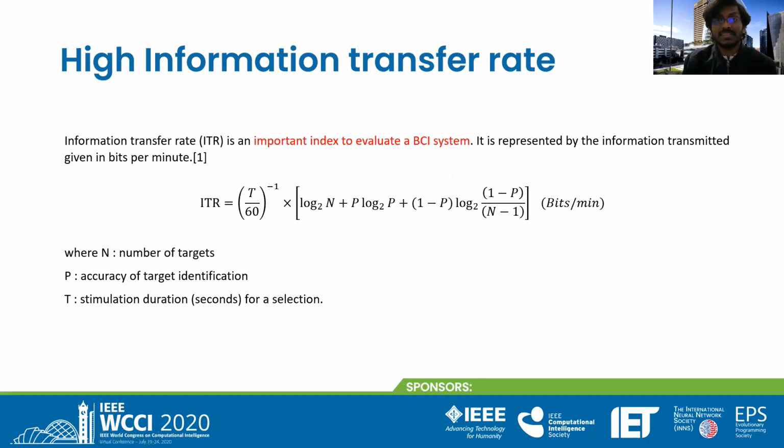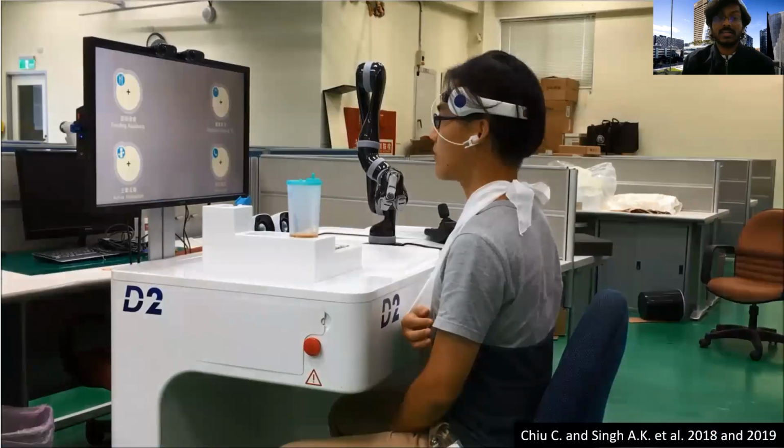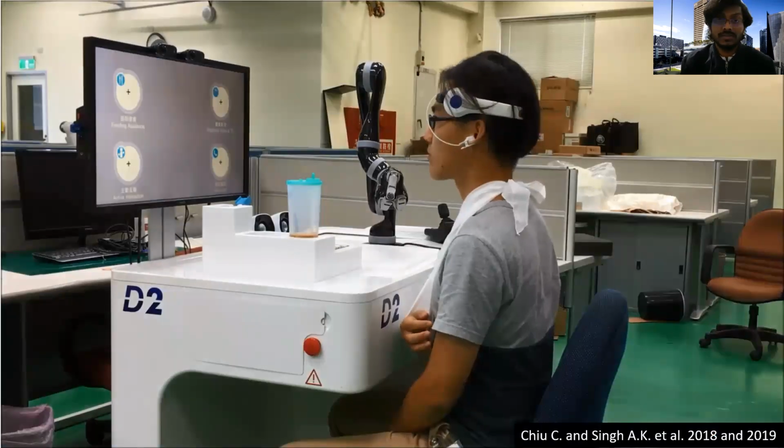But of course, the development of niche machine learning techniques is able to help us improve this SSVEP performance a lot. It's not just applied to SSVEP, of course. Like I mentioned, it's general for all BCI paradigms. And yeah, let me show you another full example of what I have shown you before of SSVEP.